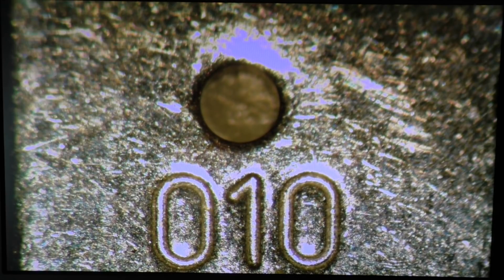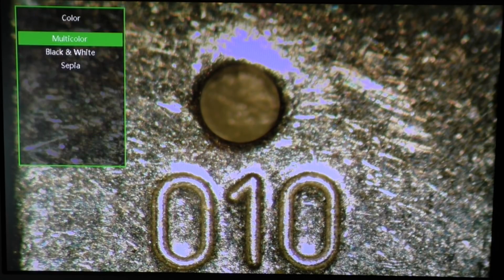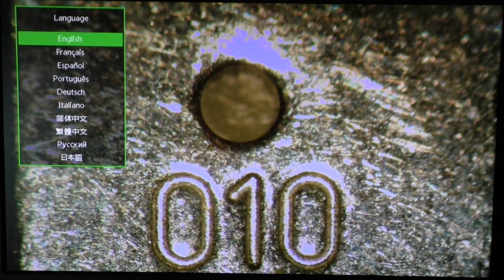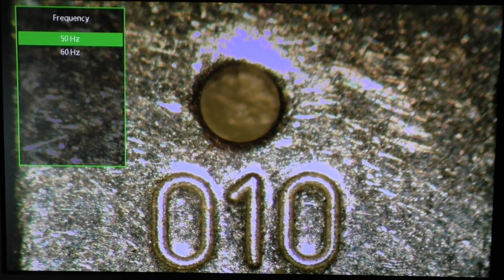Color, sorry, wrong button. Oh yes, color, black and white and sepia. Also some effects from video cameras. Language, of course, you can have English, Chinese, Japanese, Deutsch, but I prefer English because the translations sometimes are a little bit weird.